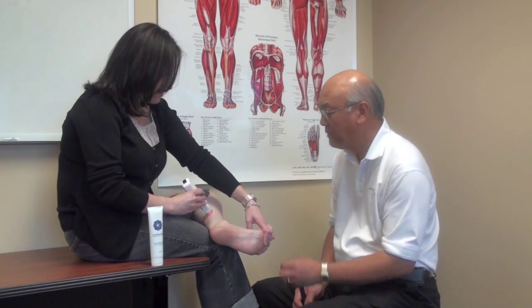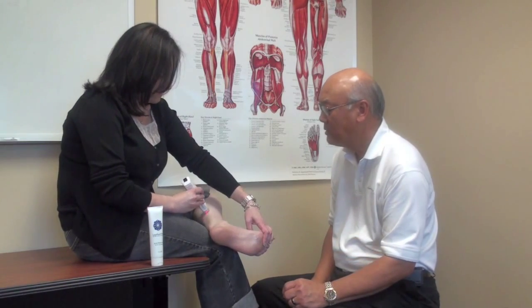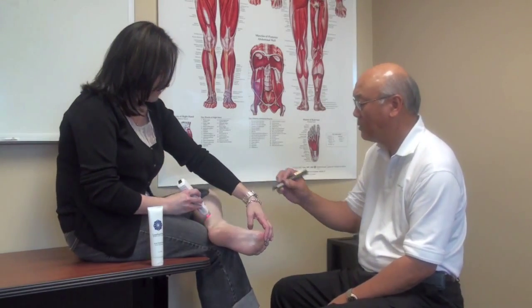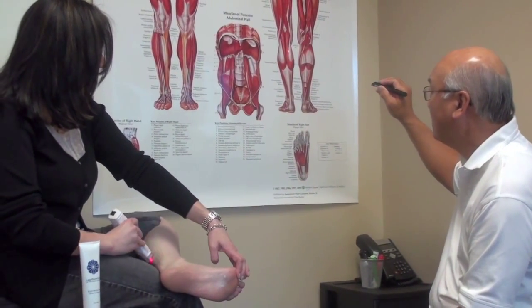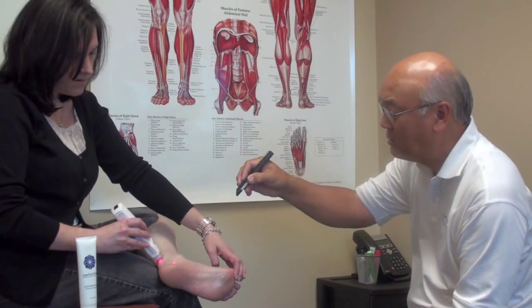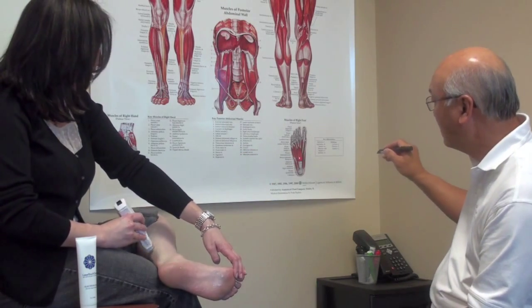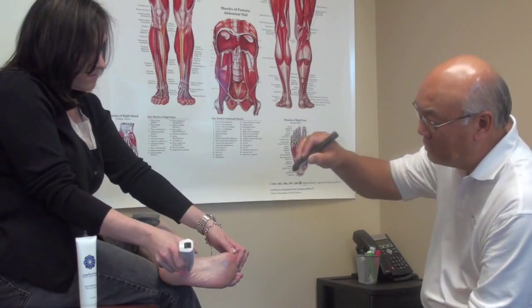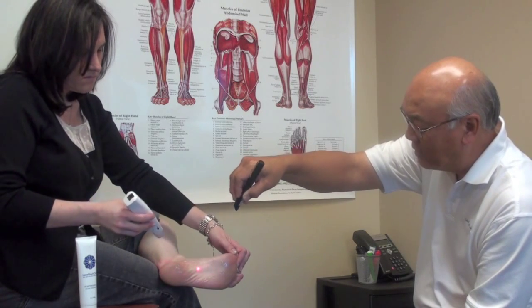Keep working them until you feel them let go. Around the heel and up through here a little bit — I'll show you on a map while you continue treating how these muscles run. If you look at the lower part of your leg, these are your calf muscles. There's an Achilles tendon that runs down here and attaches on the sides of your heel. On the bottom, you see this white sheet — that's the plantar aponeurosis or the plantar fascia that attaches to the heel bone right about where the laser light is. These are the muscles that stick out, so work that area as well.